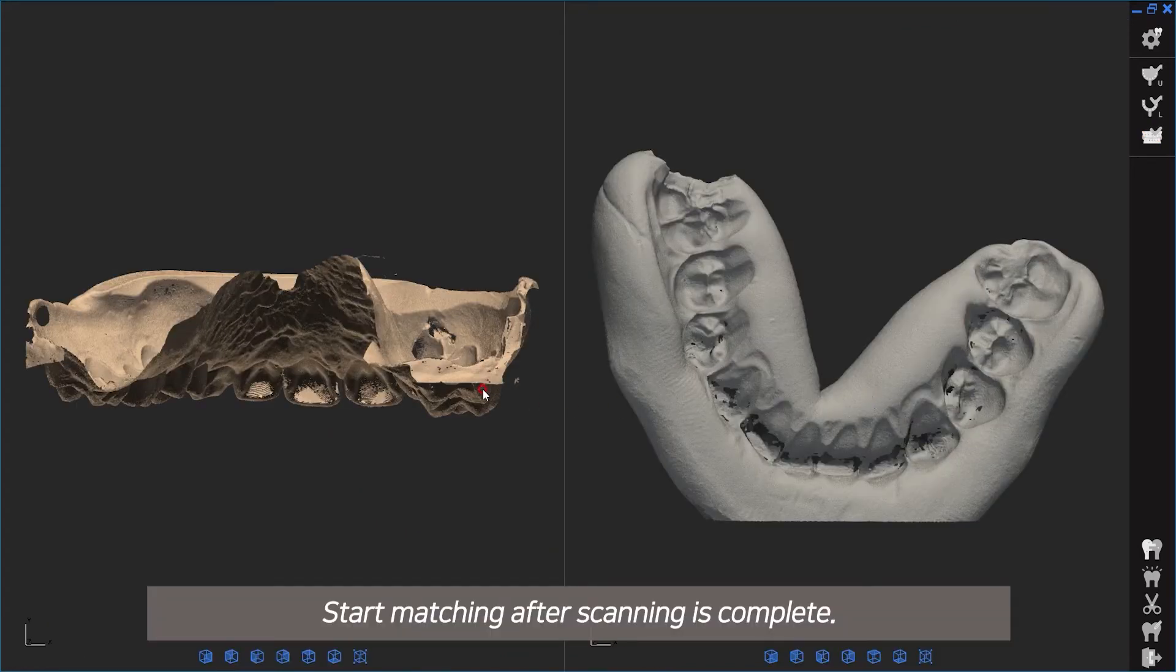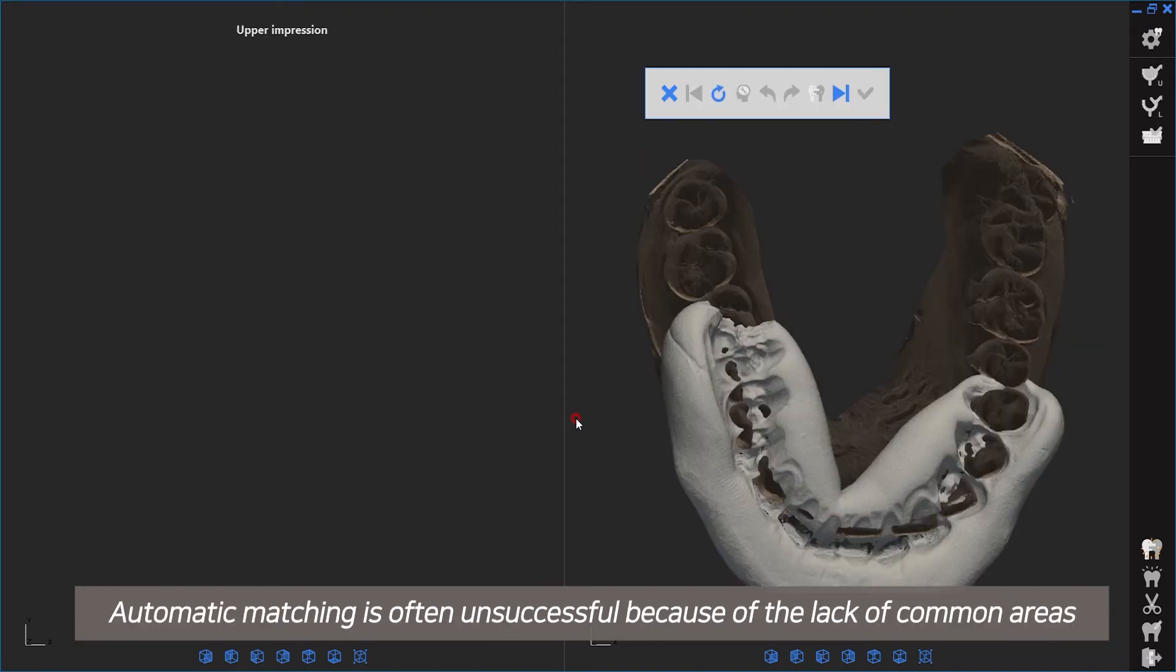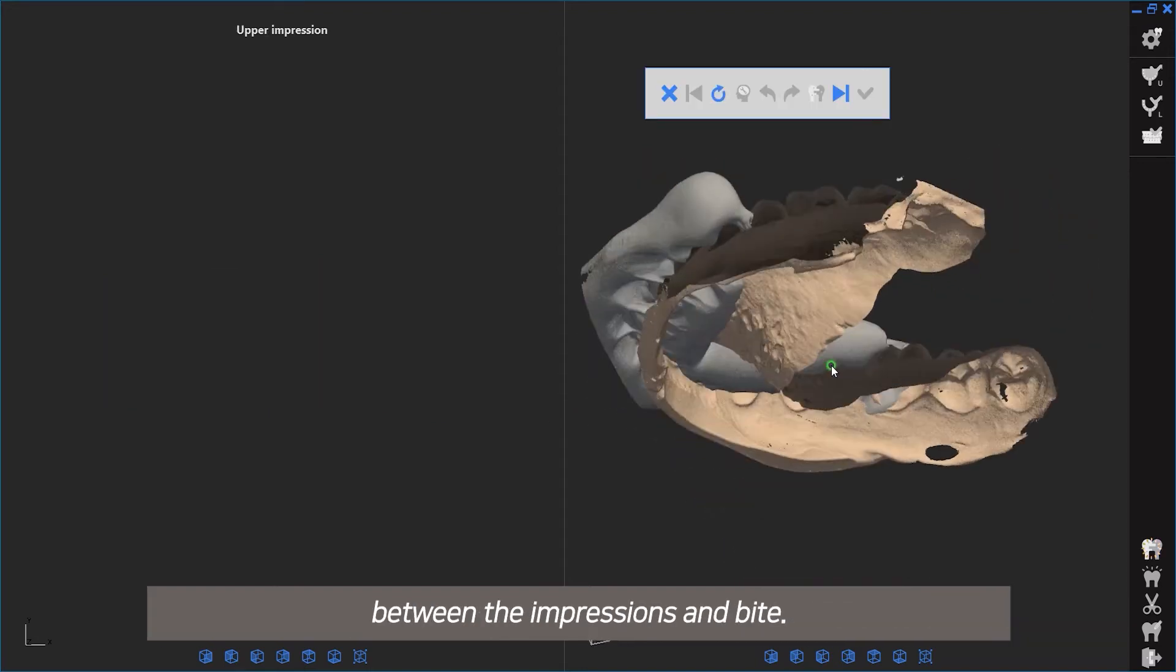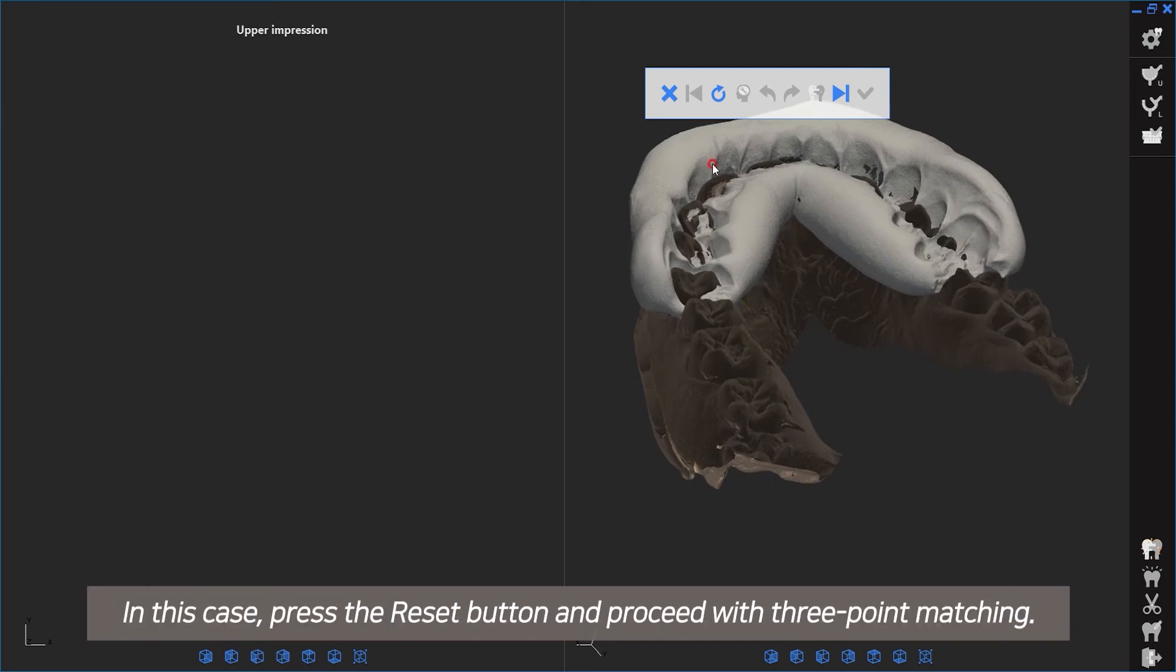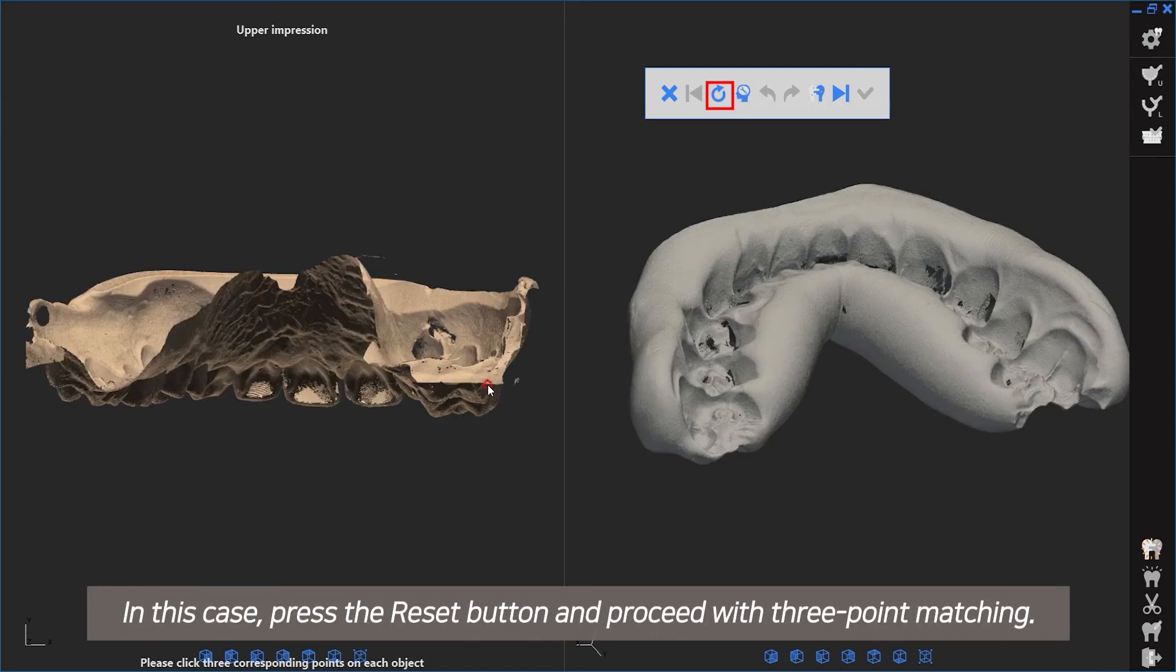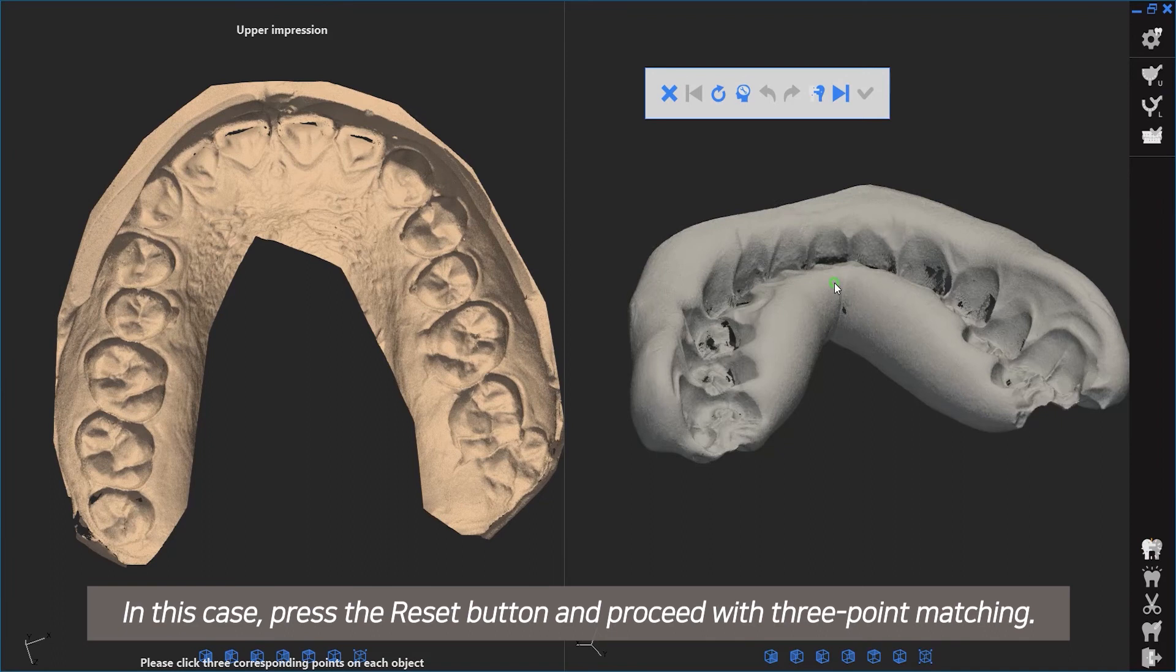Start matching after scanning is complete. Automatic matching is often unsuccessful because of the lack of common areas between the impressions and bite. In this case, press the reset button and proceed with three-point matching.